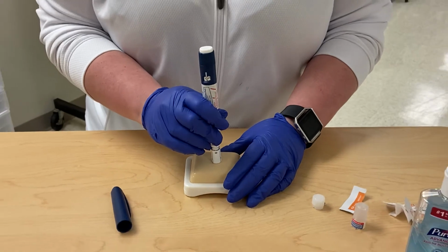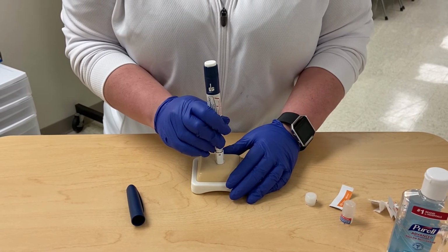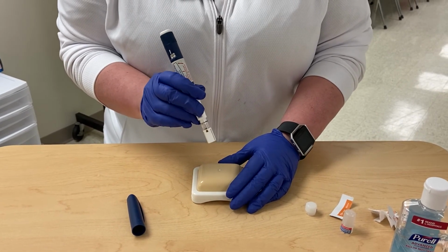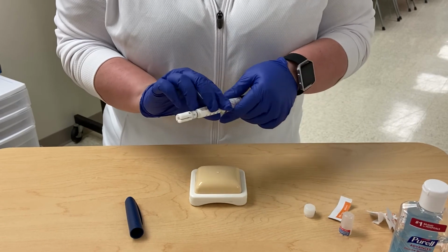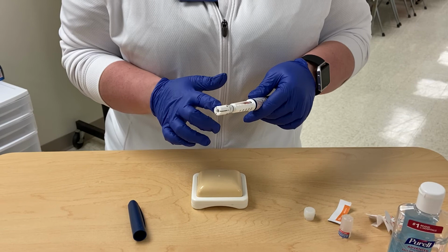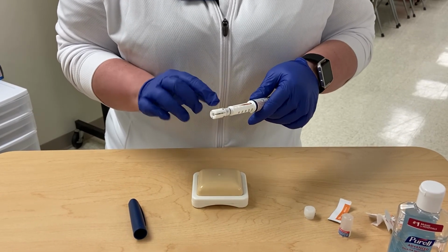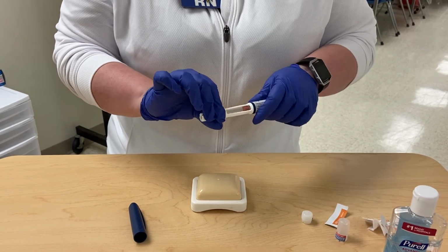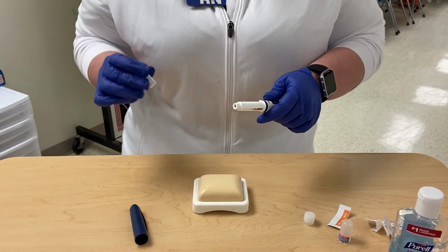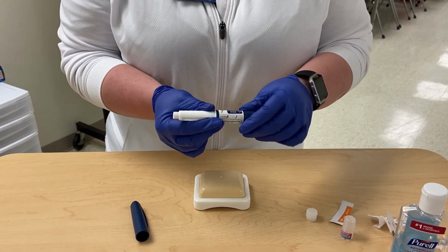Hold this position for 10 seconds to ensure that all of the medication has been introduced into the subcutaneous tissue, and then release the pen from the patient. Once you release this pen, the needle automatically contracts into the needle portion here, and then you're going to put just the needle portion, this is very important, just the needle portion into the sharps container. You keep the actual insulin pen.